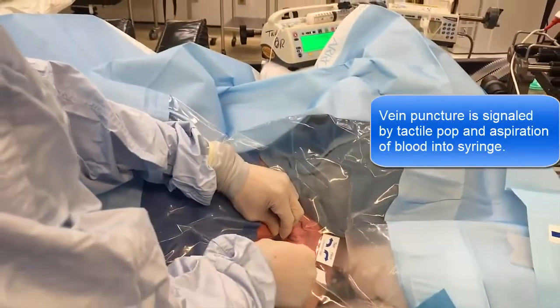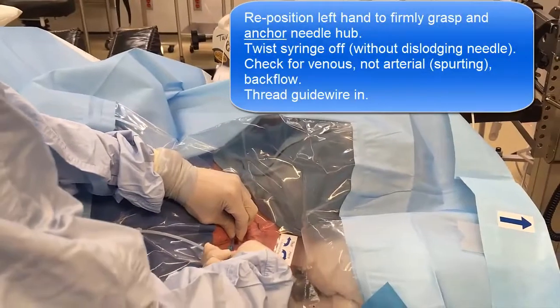And there it is — I hit the vein. Take that off. It's not spreading back.